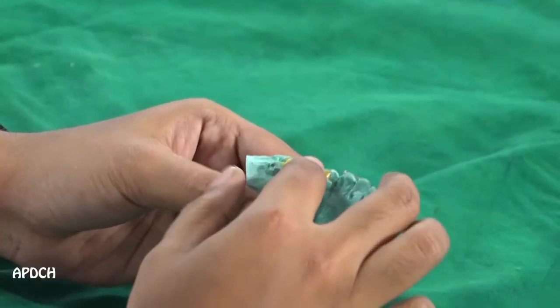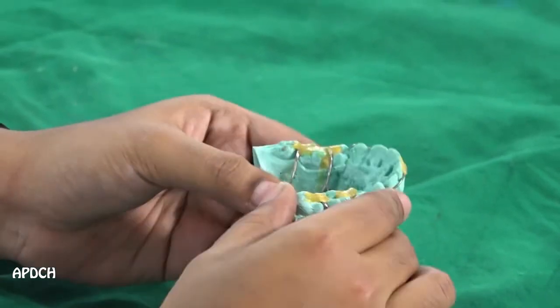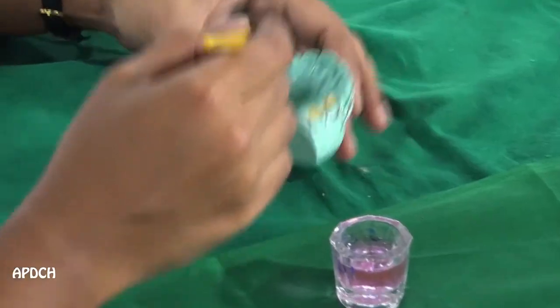Now we are going to see about the fabrication of the removable appliance — Hawley's appliance. First, I apply the sticky wax, which will hold and stabilize the wire component in its place. Then we have to apply the separating medium, because it helps in easy retrieval of the denture from the model.